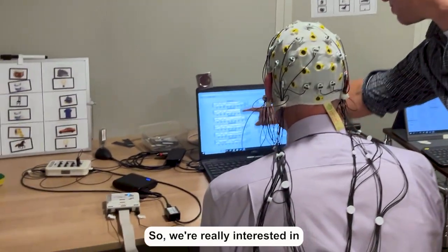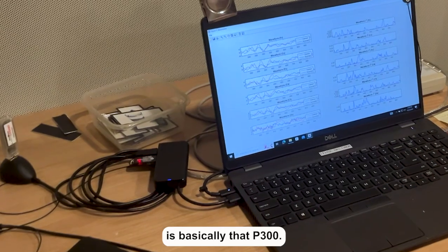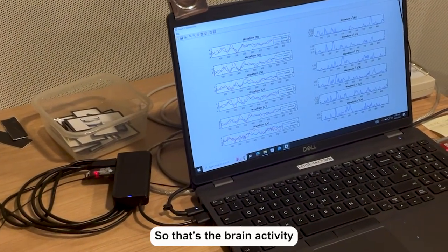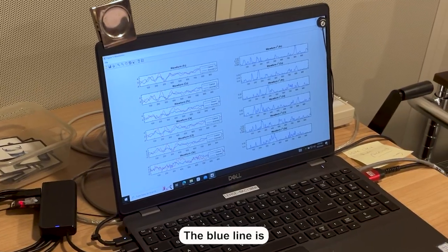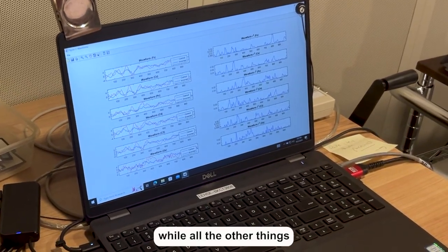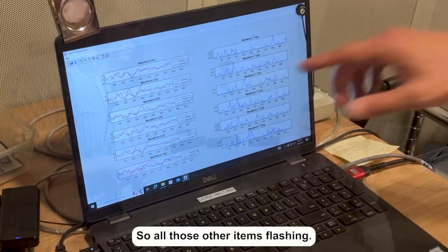So what we're really interested in is this thing over here. The red line you're looking at is basically that P300. So that's the brain activity that was happening when you were looking at that specific target. The blue line is what your brain was doing while all the other things that were flashing on the screen that you didn't care about. So all those other items flashing.